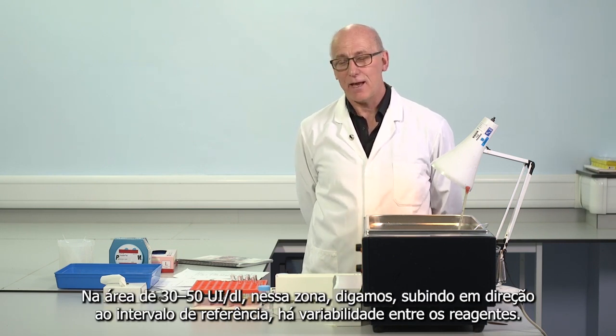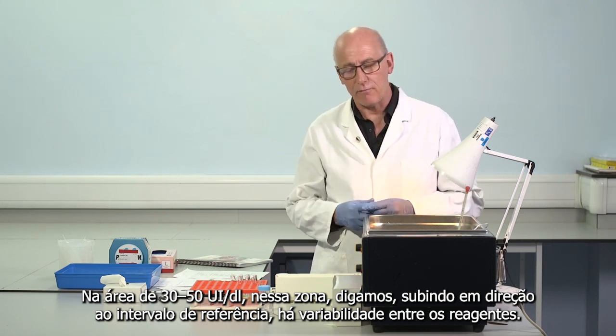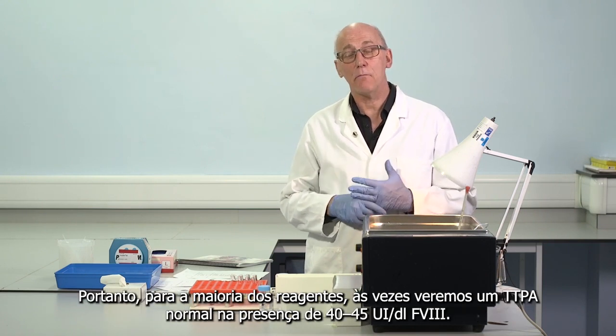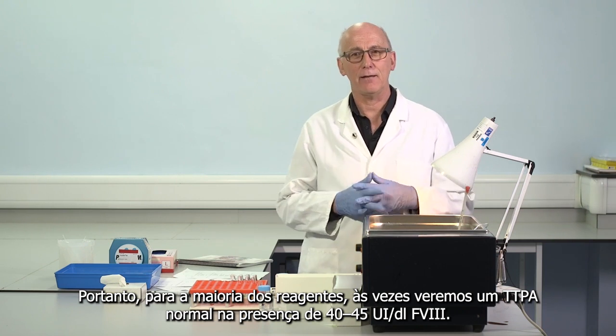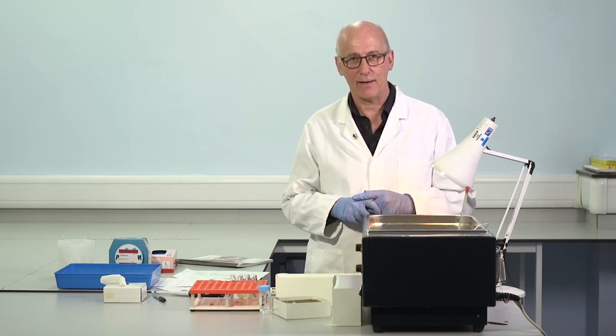In the 30 to 50 area, let's say getting up towards the reference range, there is variability between reagents. So for most reagents, we will sometimes see a normal APTT in the presence of 40, 45 units per deciliter factor VIII.